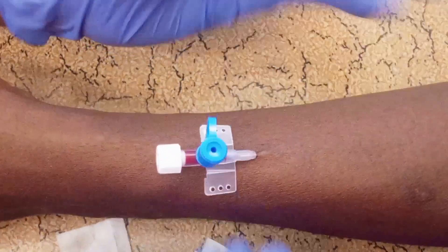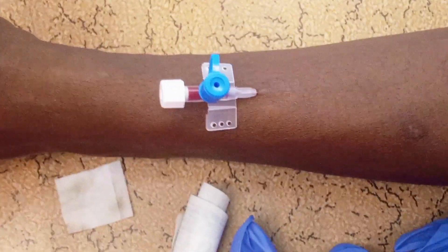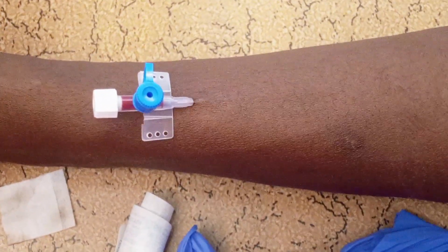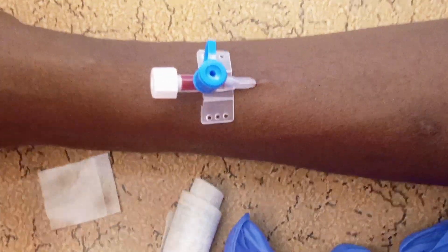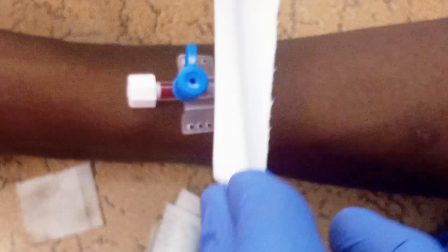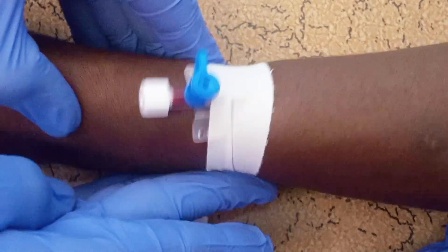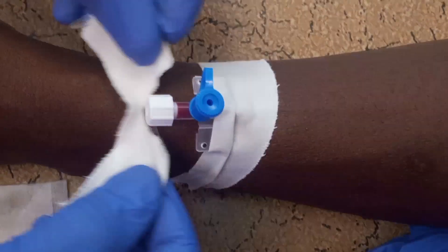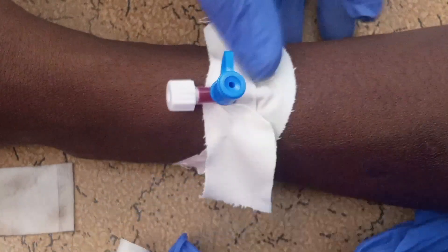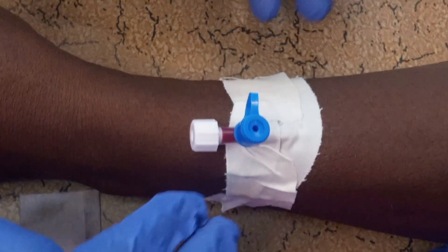Then you start dressing. You dress the cannula and secure it like this. After you have dressed the cannula, then you can flush it.